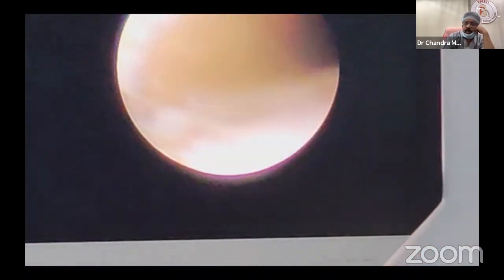This is very important in this surgery. The fifth point is that when the stone is densely impacted, it is taking a curve. If you come from the upper calyx, you may have a little advantage, but if you come from the lower calyx, you will have a disadvantage. If you come from the middle calyx, you just move the pelvic wall a little so that you create space. Ultimately, the top part of the stone will be seen to break with the pneumatic lithotripter.